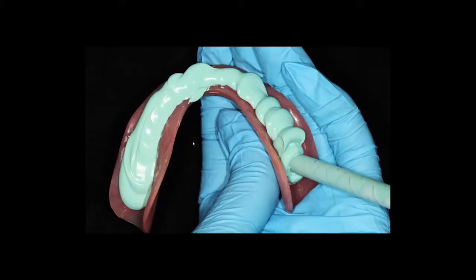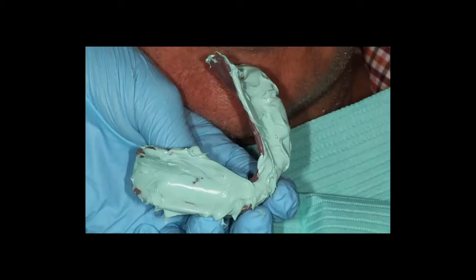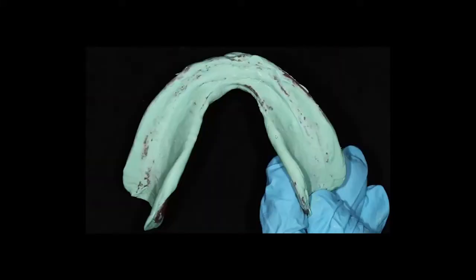Here's an image of laying the Green-Mousse into the denture, spreading it out here, and then we're going to seat it in the patient's mouth, like that. When we remove it, you'll have a nice impression here on the intaglio surface. And again, this is a very even and consistent radiopaque surface, so it'll show up really nicely in the scan.